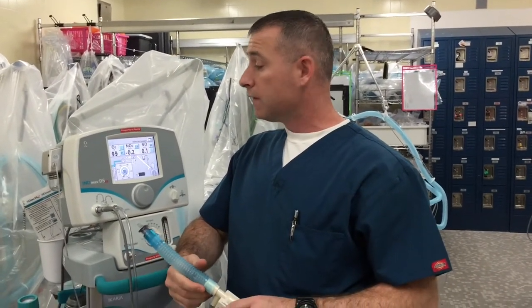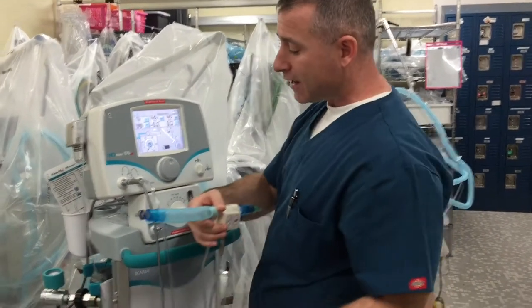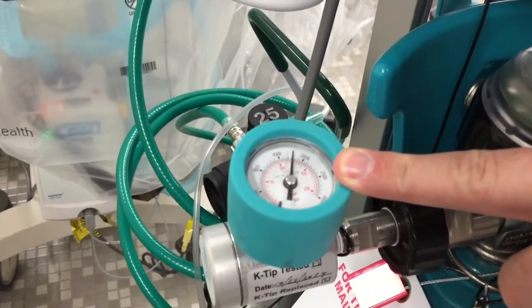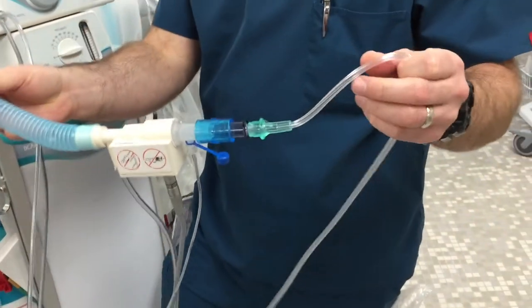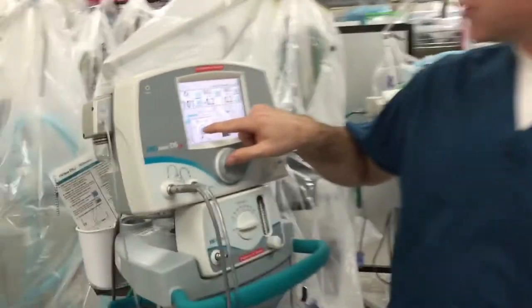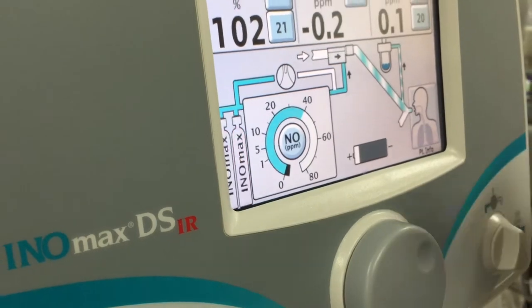We're going to pick up where we left off and do the purge and alarm verification. We still have gas in the circuit — we turn the gas on and then turn it off. Our tank is turned off, which is why we're purging the circuit. We still have a flow of 10 liters a minute coming from the e-cylinder, and now we're going to turn our dosing up to 40 parts per million.